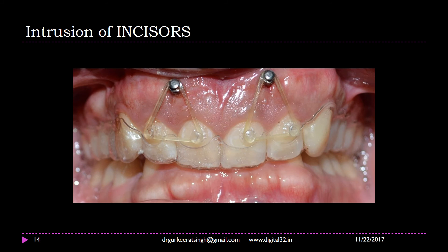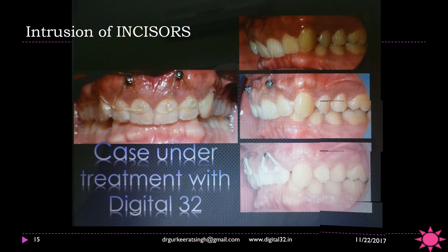Some other things you can do is place these buttons on the incisors in deep bite cases, with TADs between the teeth and clear elastics running through, to get true intrusion of the teeth. The partial coverage that the aligner provides on the incisors prevents any kind of flaring which would usually take place when we use the same mechanics in a buccally placed normal bracket setup. This is a case under treatment and within six months or less we have achieved a good amount of true intrusion of the maxillary incisors, thereby taking care of the deep bite or traumatic bite that was resulting.